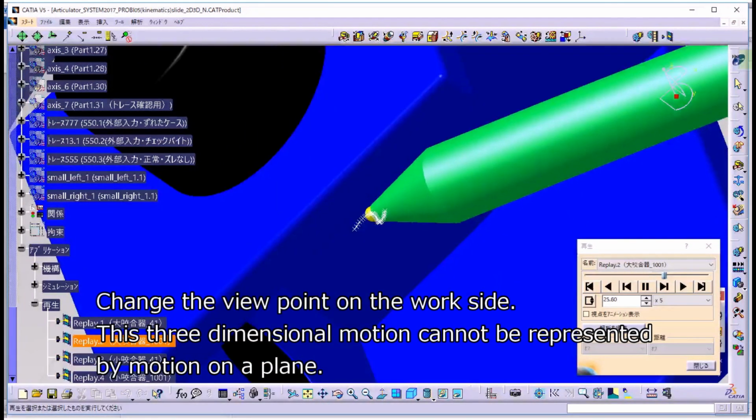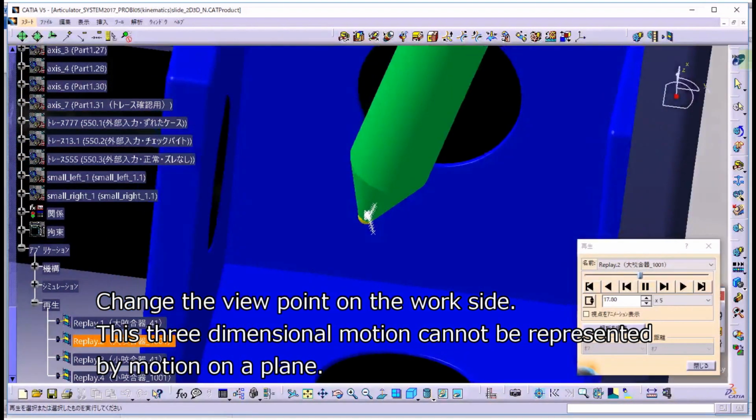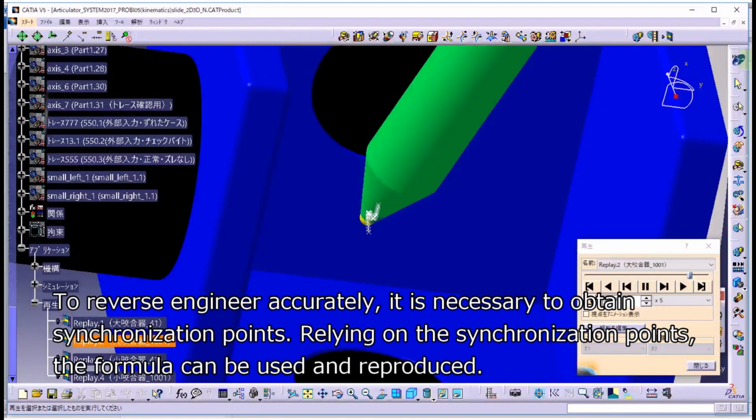Change the viewpoint on the work side. This three-dimensional motion cannot be represented by motion on a plane. To reverse engineer accurately, it is necessary to obtain synchronization points. Relying on the synchronization points, the formula can be used and reproduced.